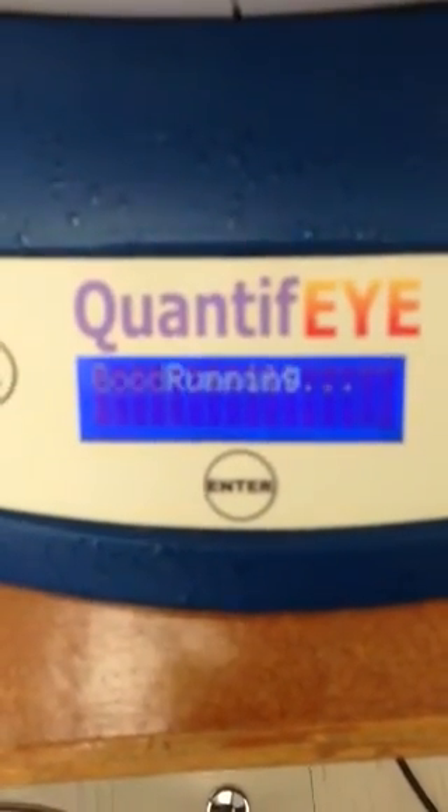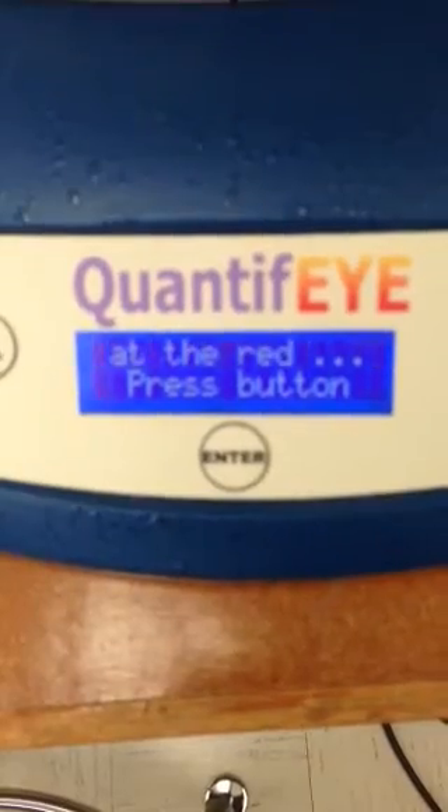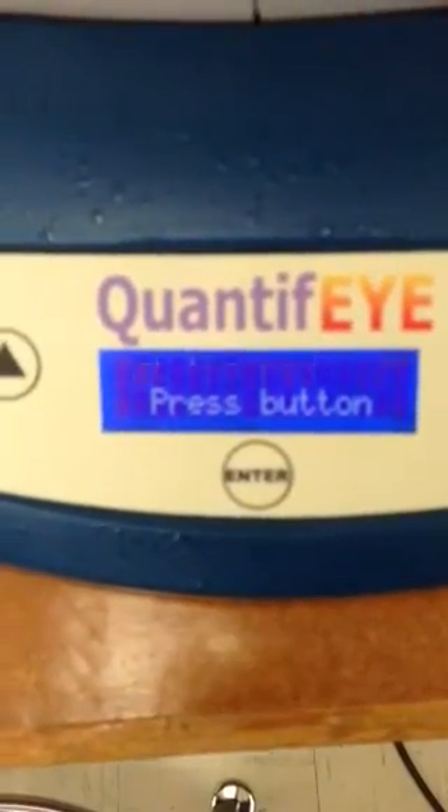That's the practice run. You'll actually get a numerical result, which is going to be a decimal number with two digits — one being perfect, representing 100% pigment — and below that is where you would normally fall.